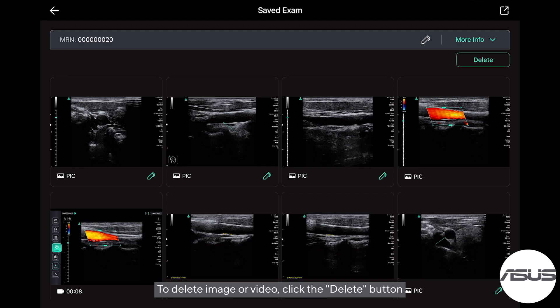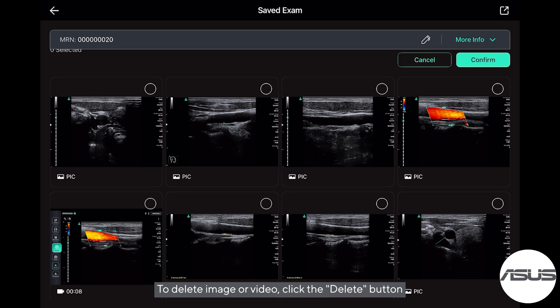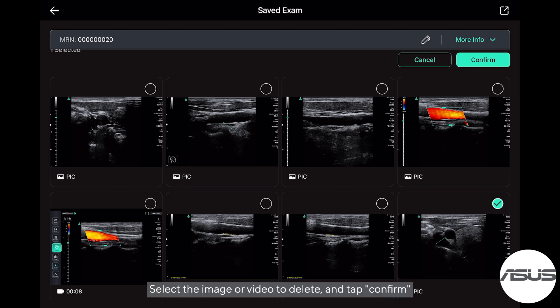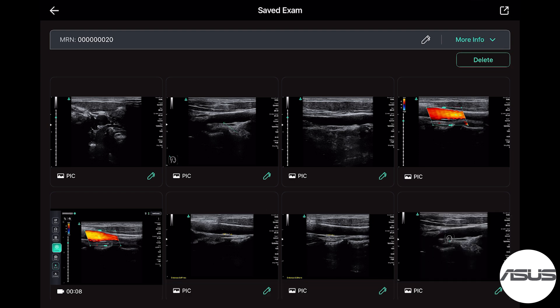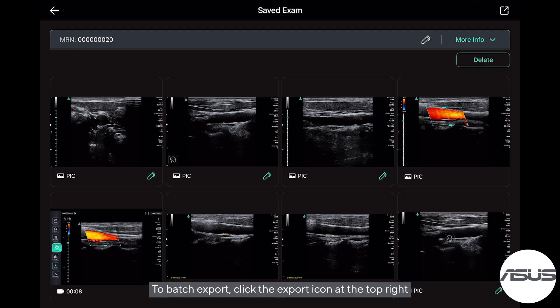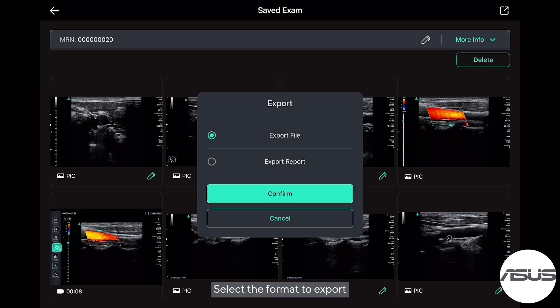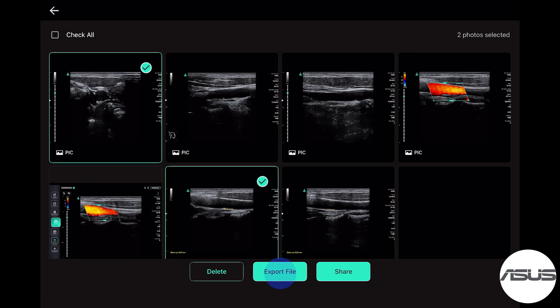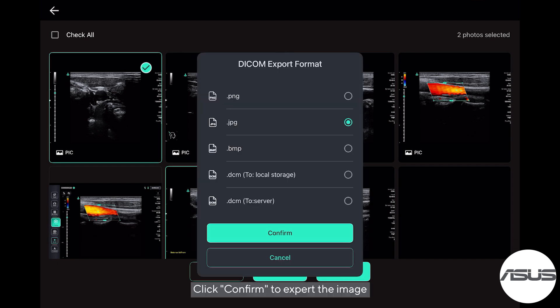To delete an image or video, click the Delete button. Select the image or video to delete and tap Confirm. To batch export, click the Export icon at the top right, select the format to export, select images, and click Confirm to export the image.